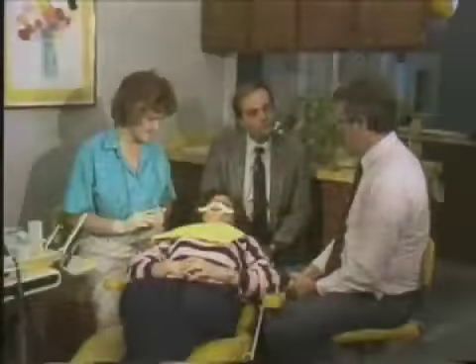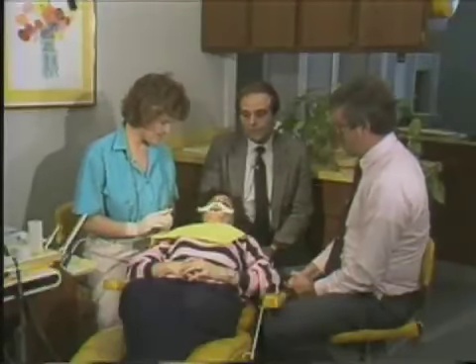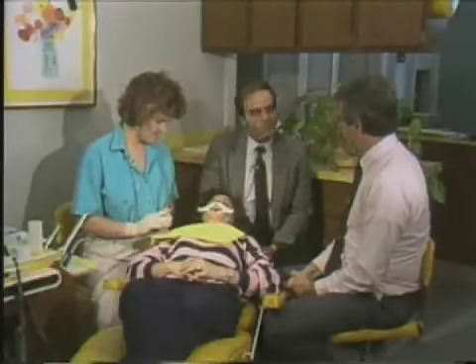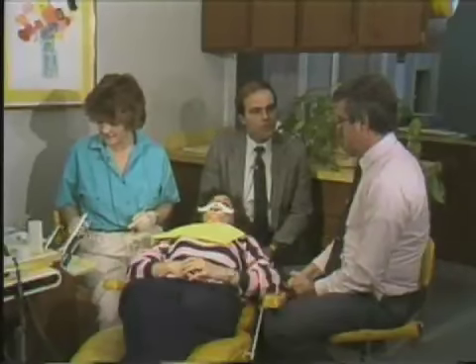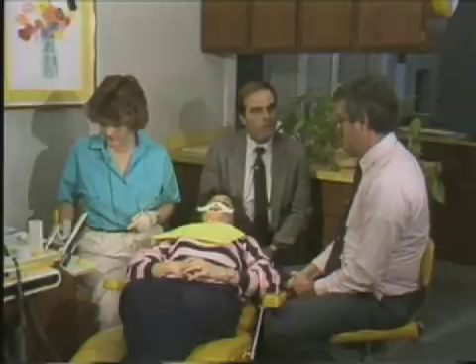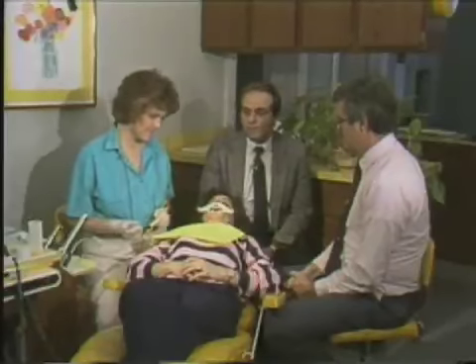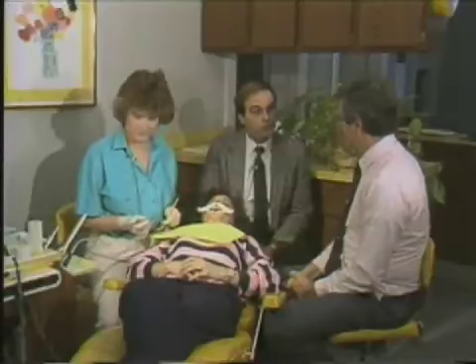Now, is it sufficient just to place the etch on the teeth, or do you want to continually add material? After about 30 seconds, it's recommended to go back and re-dab each tooth with fresh acid to make sure that the acid has penetrated the enamel properly. This is especially critical with a gel etch, which has a tendency to sit on the very, very surface of a tooth. Okay.